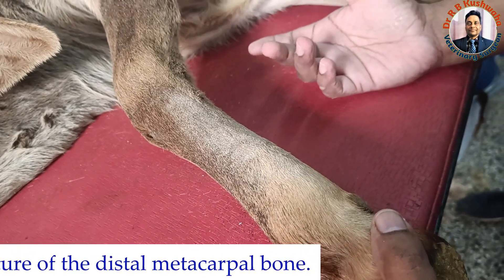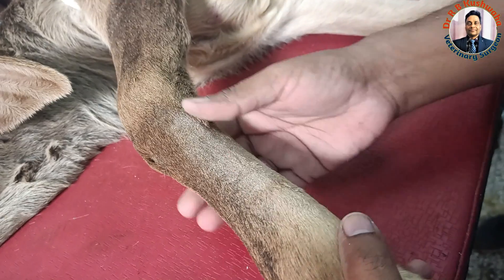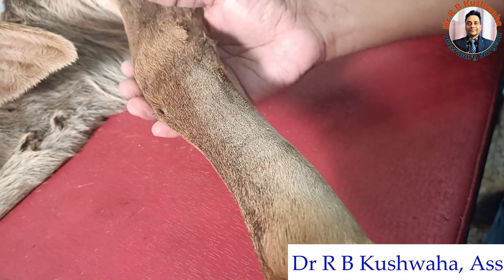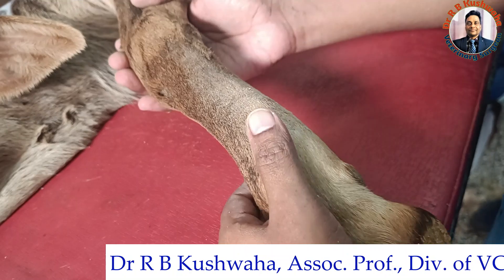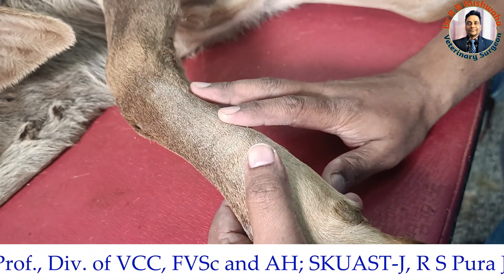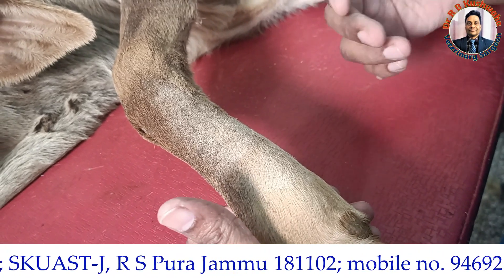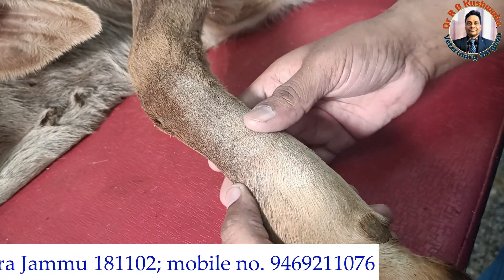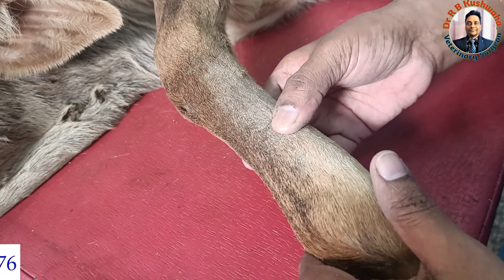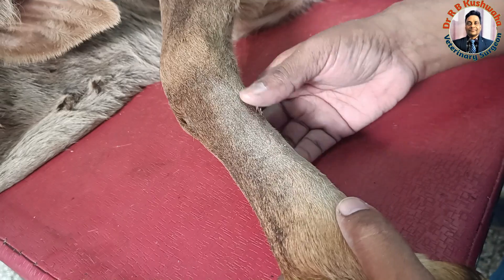The management of the fracture depends on the type of fracture, which limb is involved, and which bone is involved. This is a 30-day-old young animal and since there is no wound it is a simple closed fracture, so we go for external coaptation. For external coaptation there are different approaches: simple splint and bandaging, splint bandage followed by plaster of Paris bandage, or fiberglass or synthetic cast. For this animal since the fracture is closed and the weight is very less, we go for plaster of Paris cast.